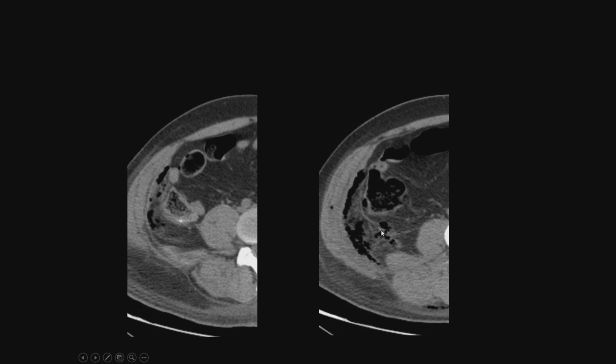And it was perforated, but how come this acute appendicitis was perforated and it didn't show intra-abdominal, intraperitoneal gas? It was because it was perforating into the retroperitoneal space. So we had to make sense of this. We had to decide how this appendicitis is related to the empyema. So we have two things right now: an abdominal wall infection with an acute appendicitis, and an empyema.